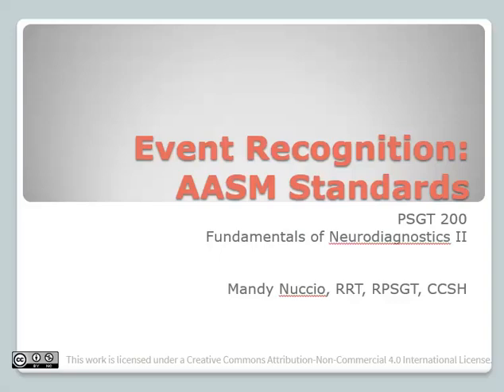None of this should be new. We already covered this last semester, but I'm going to go through it again because it'll help you be able to review the sleep studies that you have staged, to be able to go back and determine if they're kicking, if they're having respiratory events, anything like that.